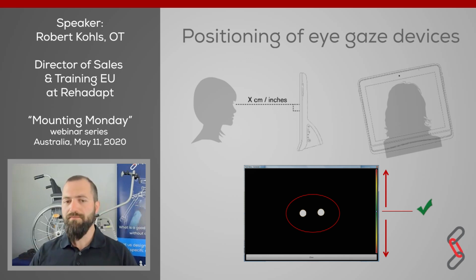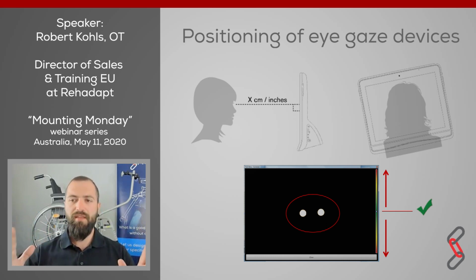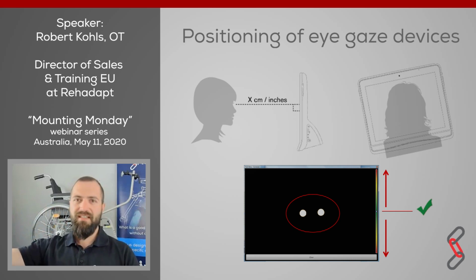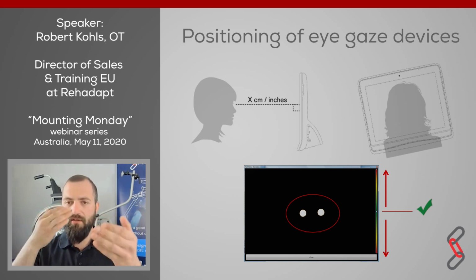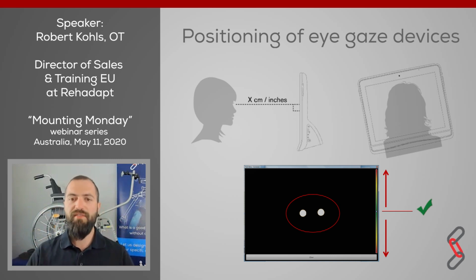The wheelchair mount needs to guarantee that the communication system stays all the time in the same position where the customer needs it. As you can see on these example pictures, we need to cover a wide distance of about 50-60 centimeters between the face and the screen of the device, and the track status, where the camera system recognizes the eyes, and also the right distance must be positioned very well.